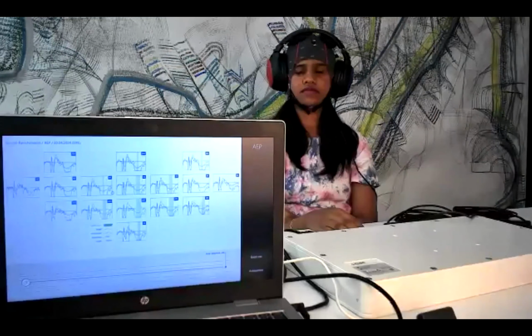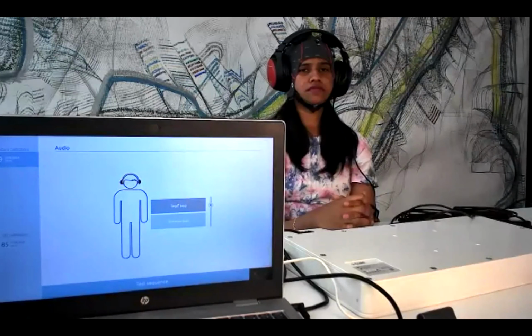We could try a quick test. In this case, we'll see if this would work. So we can start a quick test to run. Basically, a quick test is just a short real-time assessment. Usually we do this when the accuracy is high. So still the high tones and the low tones. Every setup is the same. And we'll just try this one. It will be about 1.5 minutes.